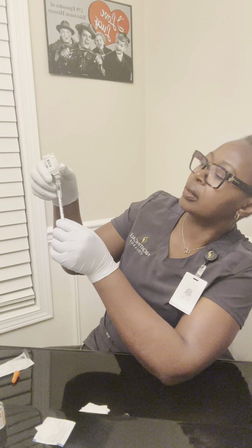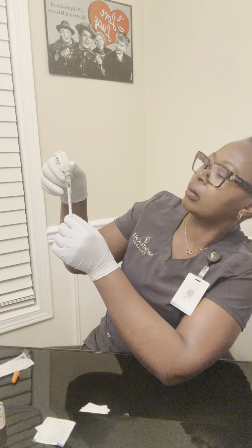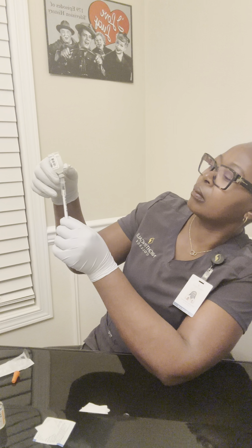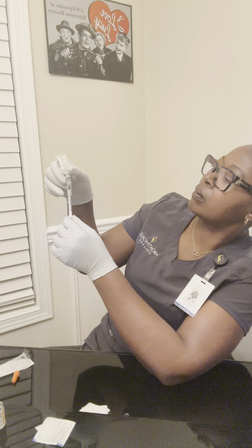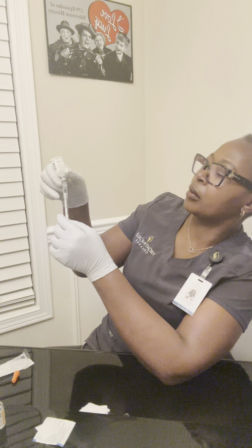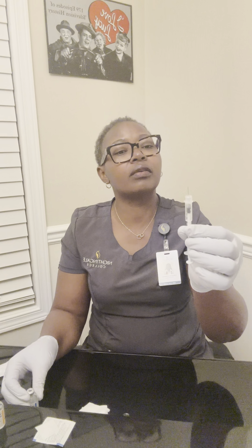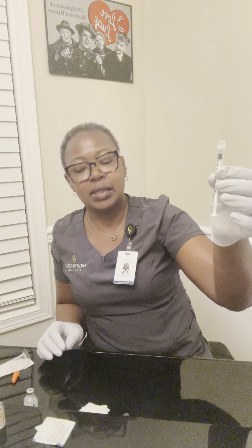So I'll use my 10 mark. I need 12 units, and that's what I have.